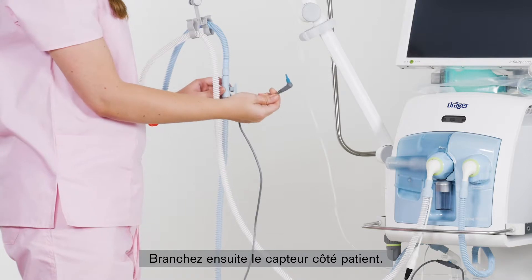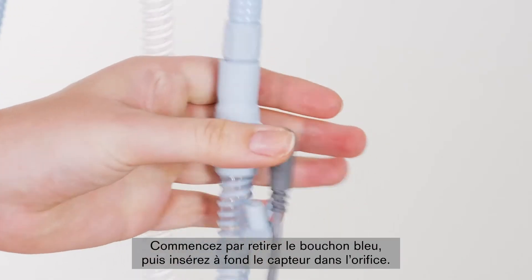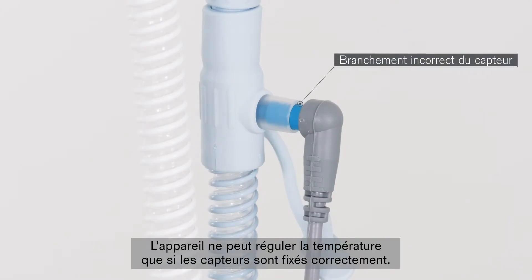After that, connect the sensor on the side of the patient. Connect it to the connector provided for this purpose on the inspiratory hose. To do this, you must remove the blue cap and insert the sensor into the opening as far as it will go. Unless the sensors are properly fastened, temperature regulation of the device will not be possible.